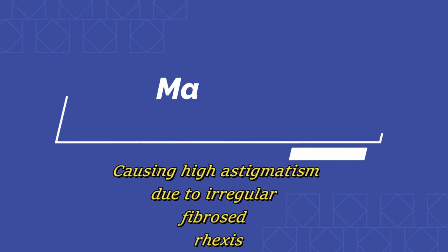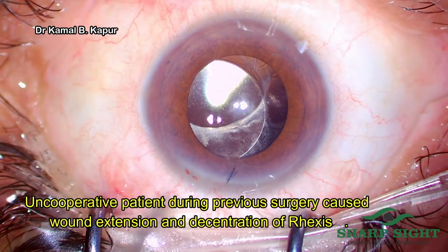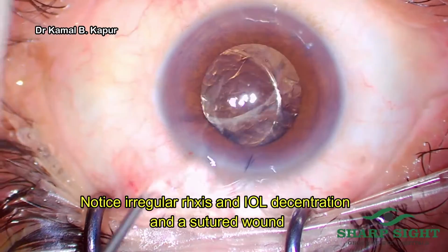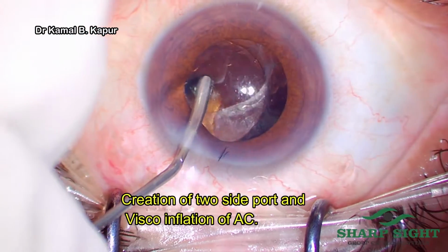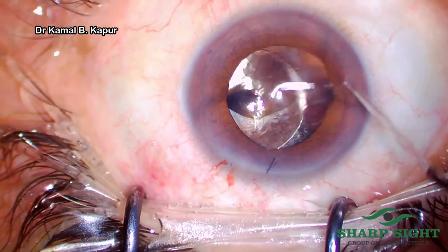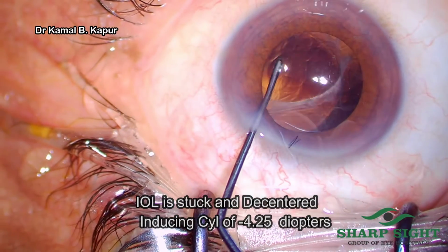This is a case of a decentered IOL due to an irregular rhexis caused during a previous surgery when this patient was very anxious, and she even moved and enlarged her main entry wound during surgery. Thus you see a suture there, and also extended the capsule rhexis during surgery, which ended up giving her a decentered irregular rhexis. We notice that there is a capsular fibrosis and adhesions between the anterior and posterior capsule, and also an overhanging thick capsular edge over the IOL.